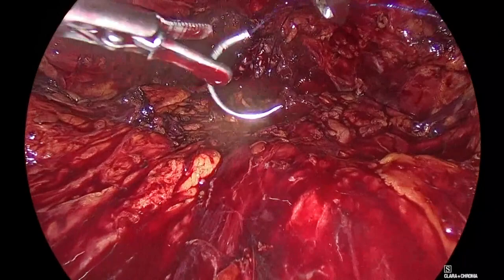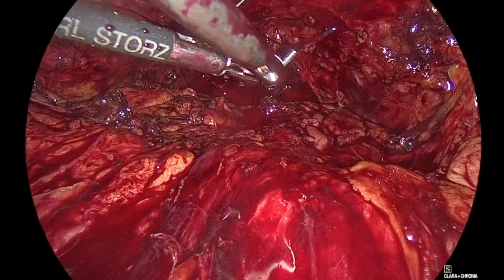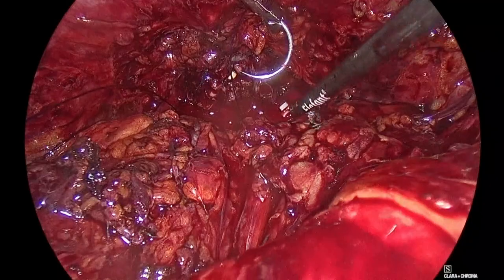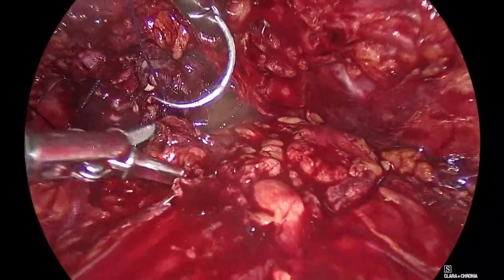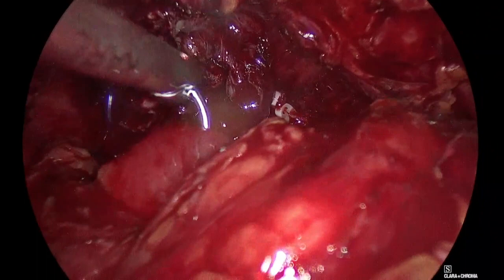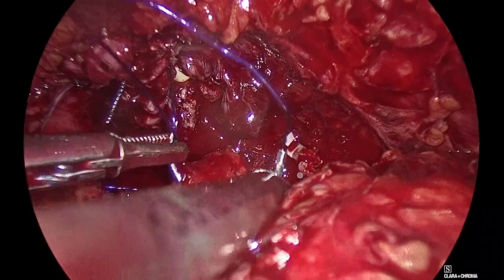So now the second suture is on the bladder, 6 o'clock, forehand. Aspirate, please, now. Inside, come close, Padeli, close. Good. Aspirate inside. Good. Show me. This is a strong bite at 6 o'clock. This is what keeps the anastomosis, guys.